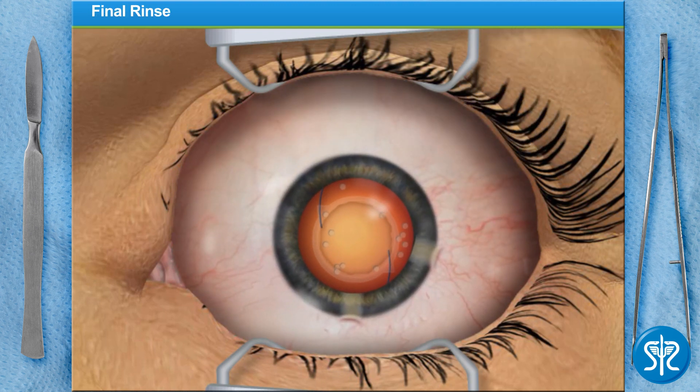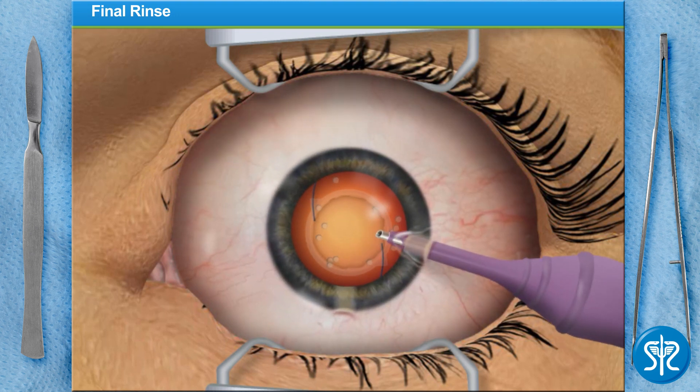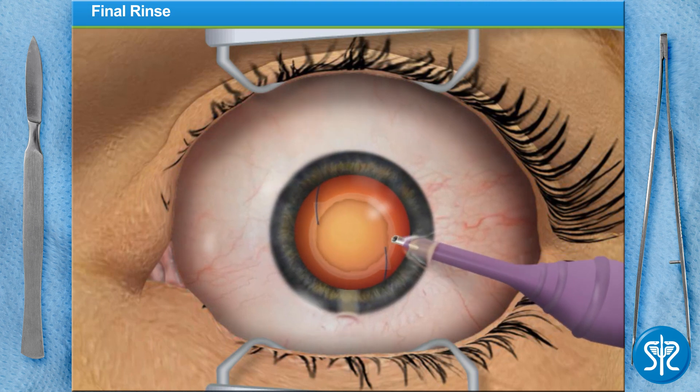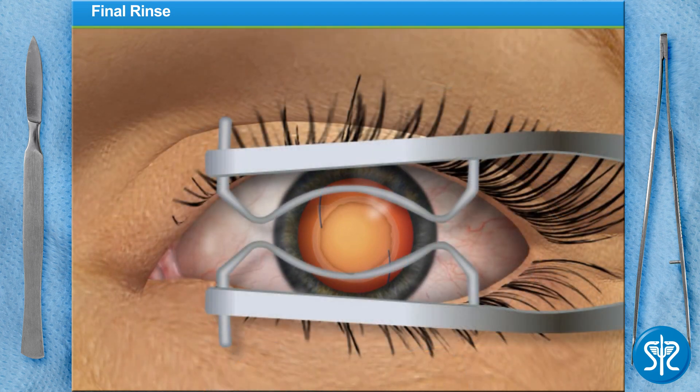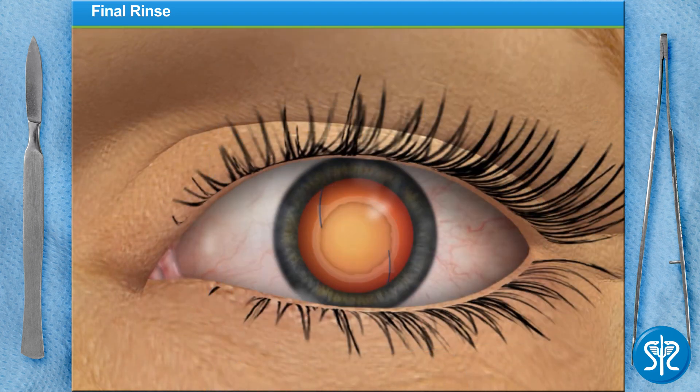The thick fluid we added to the eye will need to be removed, and any remaining microscopic cataract fragments should be rinsed out as well. The incisions in the eye are generally self-sealing. Very rarely do we need to add a suture to close the incision. In our patient's case, we don't need any sutures.